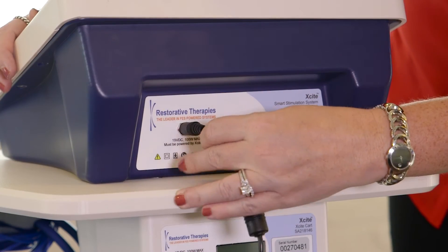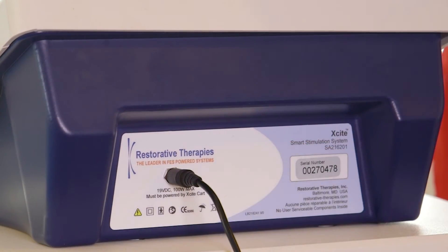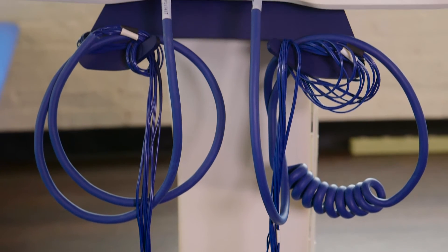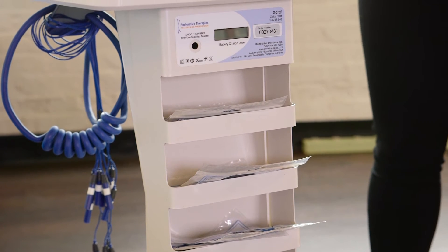The power plug can be removed for even greater flexibility of movement. When the battery needs recharging, just plug it in. When you are finished, or if you simply need to put the controller in a safe place while you make an electrode adjustment or other intervention, you will always have your electrodes within reach thanks to these convenient electrode holders located on the rear of the station.